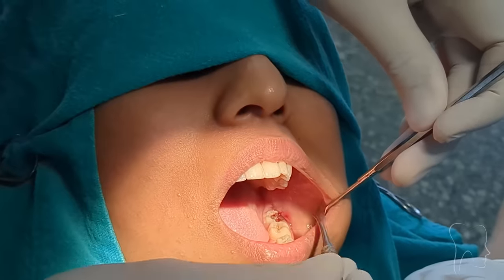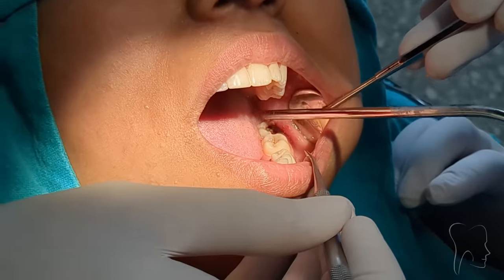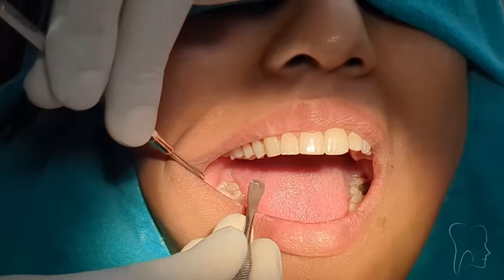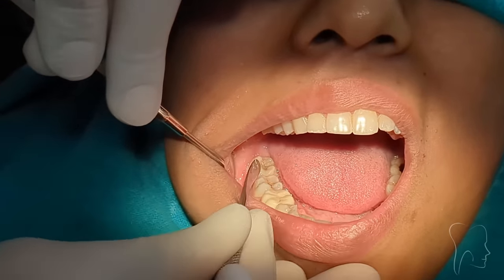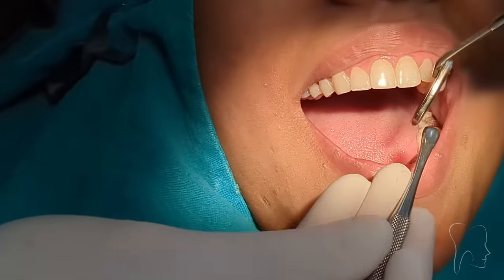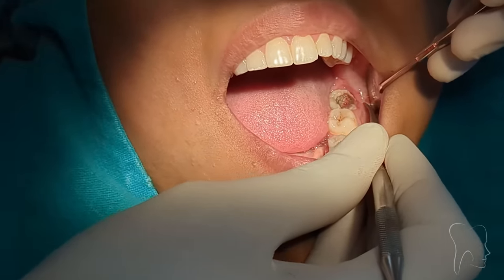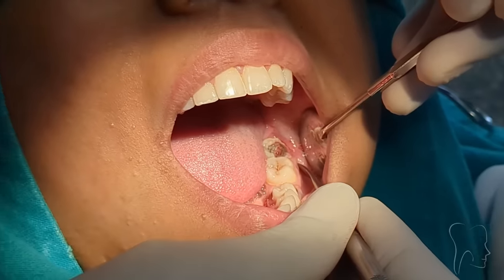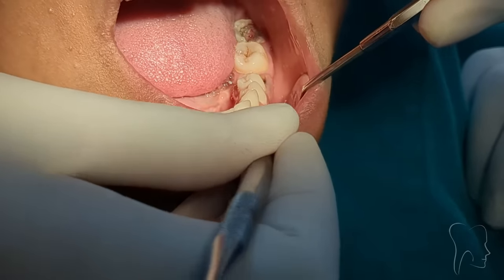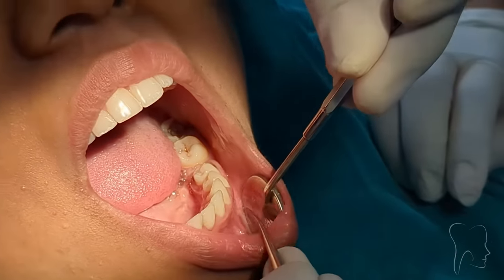So I will show you what I do with all my patients. First I show the patient what actual pain is — I am going to poke the mucosa on the opposite side where I have not given the local anesthesia, with the blunt end of the periosteal elevator. The patient has reacted to the pain. Now when I show it on the side where I have given the LA, even if I press a little hard, the patient doesn't experience any pain. Just to make sure the inferior alveolar nerve block has acted, you should check it anterior to the mental foramen — that is the premolars and canine region.